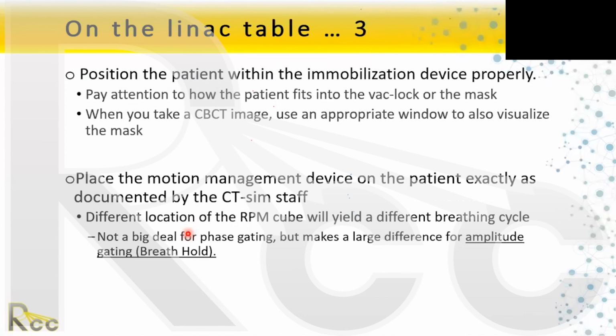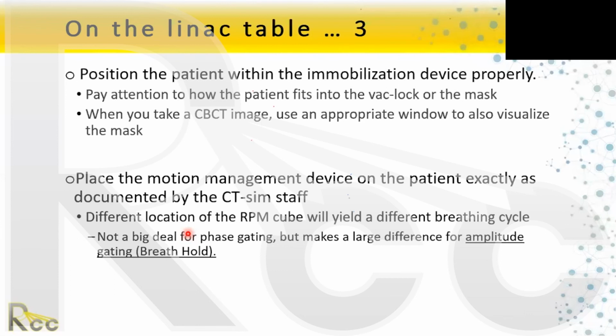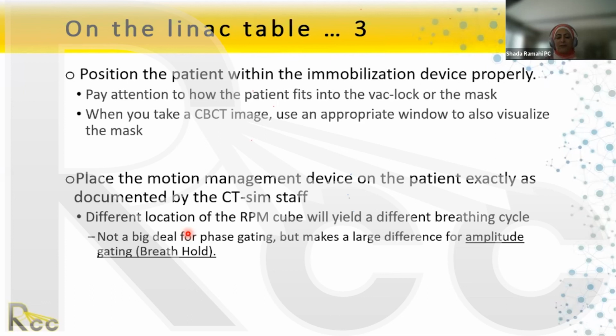My question is if there is no alignment for SRT, we can go on treatment, but for normal treatment, we should rescan. Is it okay? Again, if we don't have proper alignment with SBRT, we have to align. Yeah, we have to align. But if the brain is not fit well or something like that, as you mentioned. Anyway, that's why you do the CT scan, the CBCT scan, and you try to fit the patient in the mask. If we make it and the patient is well fit, but not aligned, because the simulation is not good, we can treat. The simulation and the planners didn't catch it, and it's the physicists' decision: do we treat or do we re-CT sim? No, the physician said we treat, but we have to reproduce the same crookedness.